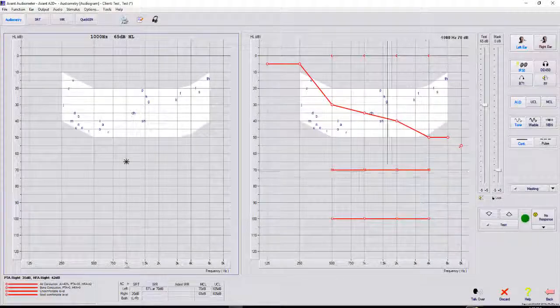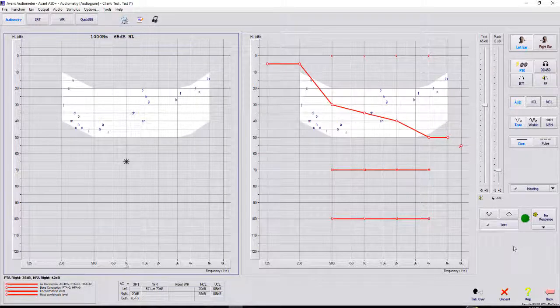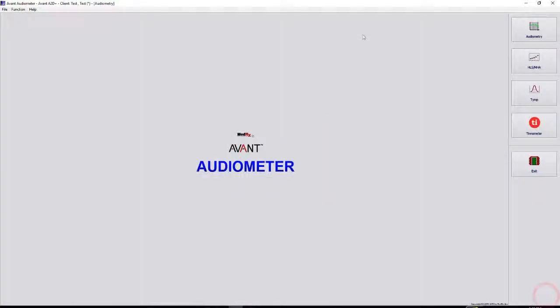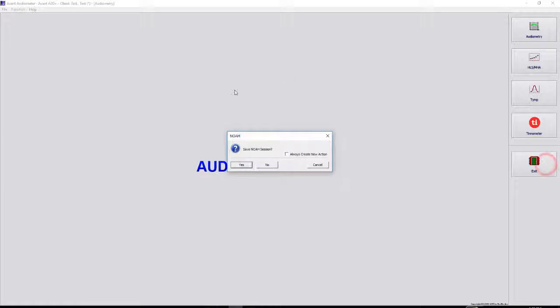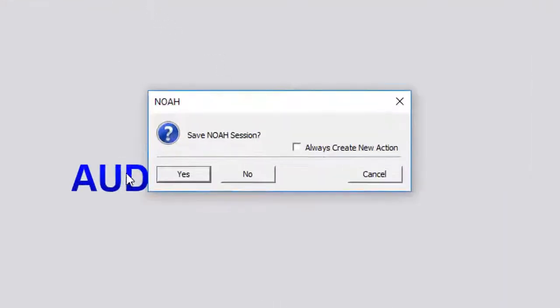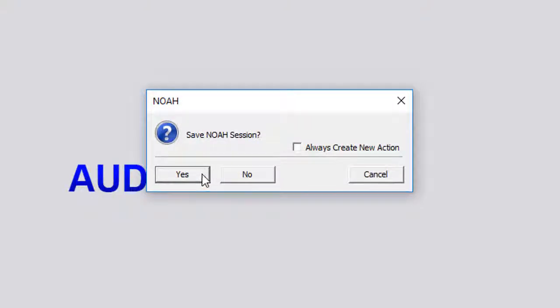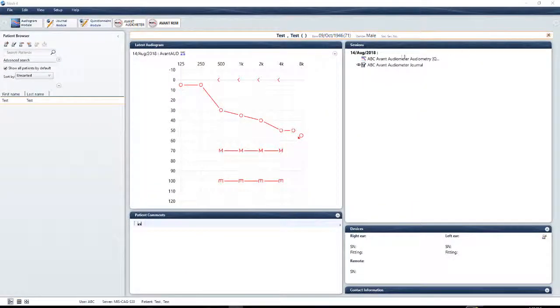Going back to the main title page, we have our back button in the bottom right hand corner. Once we are done with audiometry, you can always hit exit here. And as long as you open it up through NOAH, this prompt is going to come up to save the session to NOAH. So if I were to hit yes, there's our session from today.